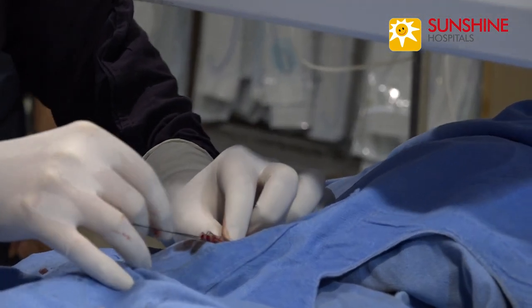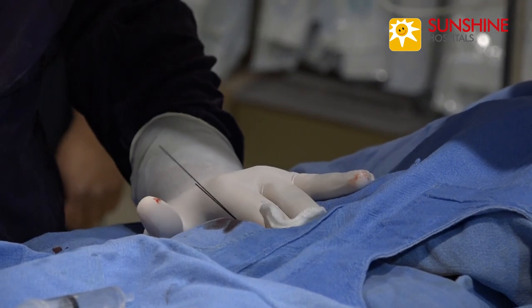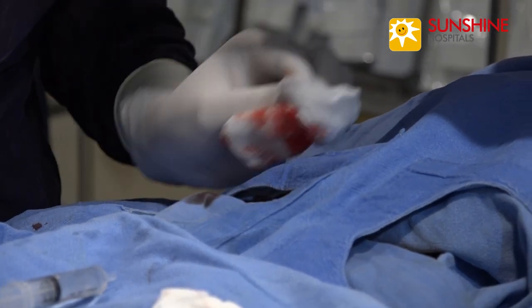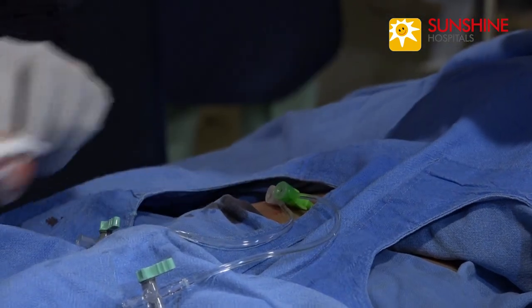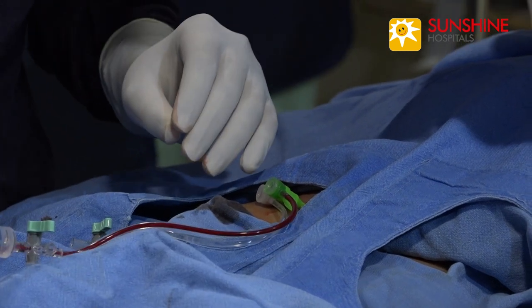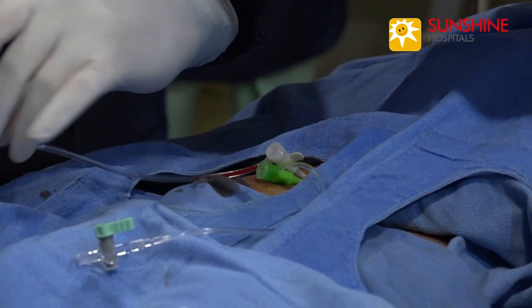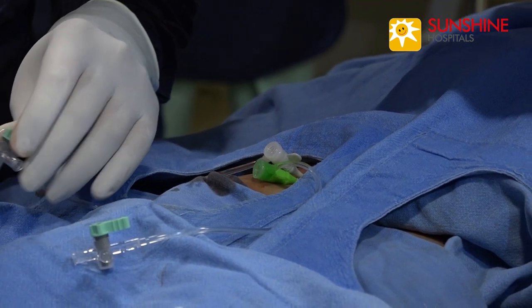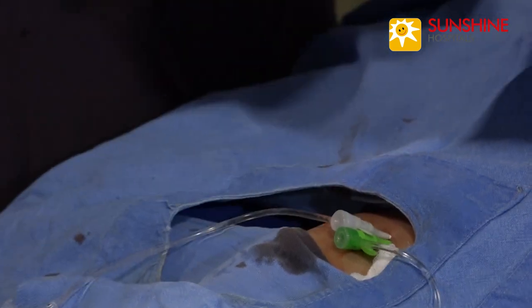The basic steps in PDA closure are, number one, first we have to put two sheaths, one in the right femoral artery and the second in the right femoral vein, 5 French sheaths. These are the two sheaths, one a femoral vein sheath and another a femoral arterial sheath.